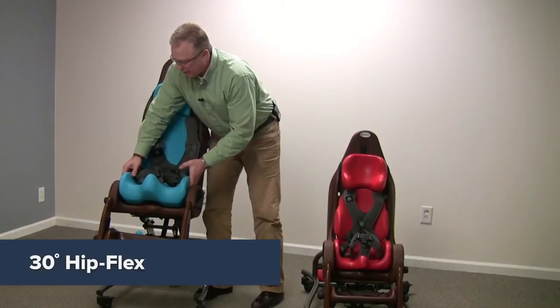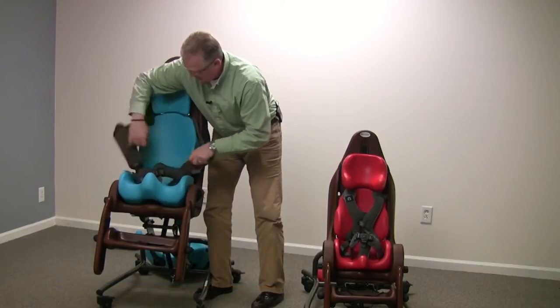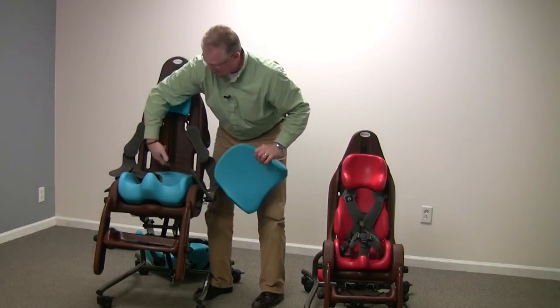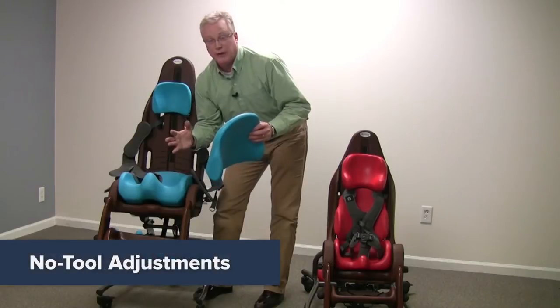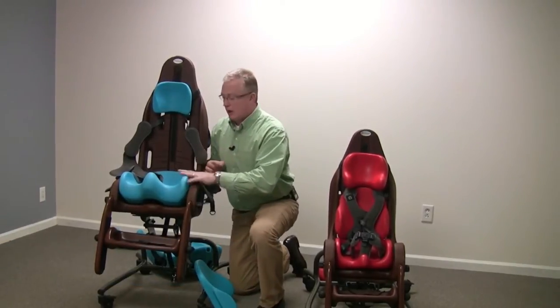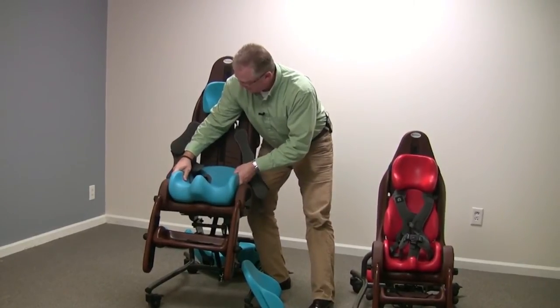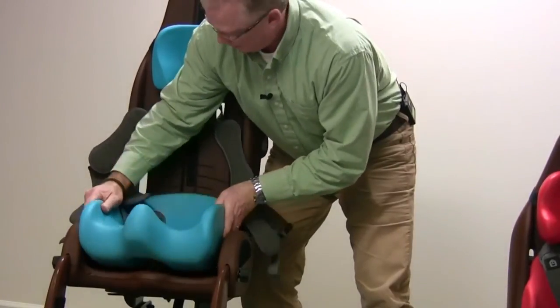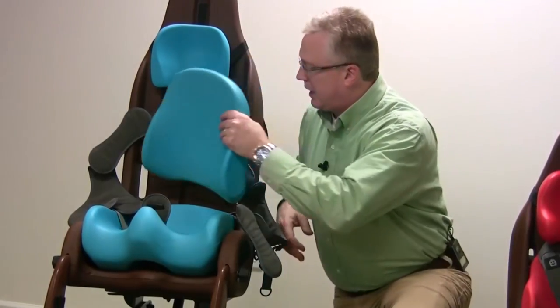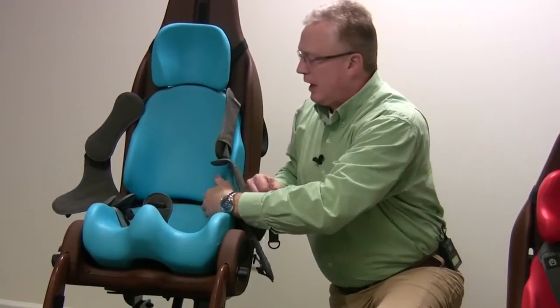There is a 30-degree hip flex angle adjustability. You can take the back off just like this — everything rides up and down on the track. This is all adjustable with no tools. The Special Tomato High-Low seating system requires no tools to adjust anything. You have 30 degrees of hip flex — 15 degrees of flexion to 15 degrees of extension — all with no tools. You just take the child out, readjust the seat, put it back in, it seats and supports itself, then add the backrest back on at the proper height.